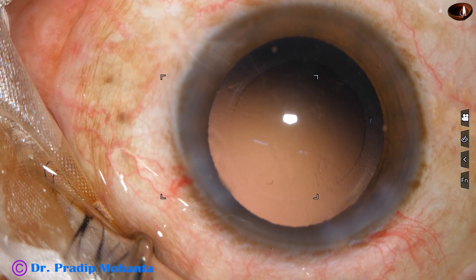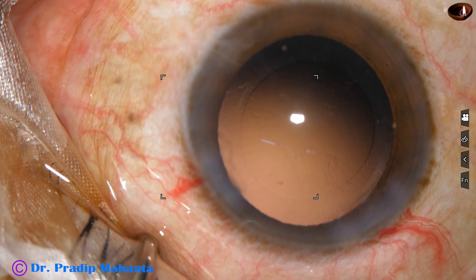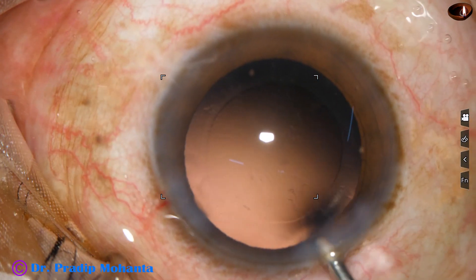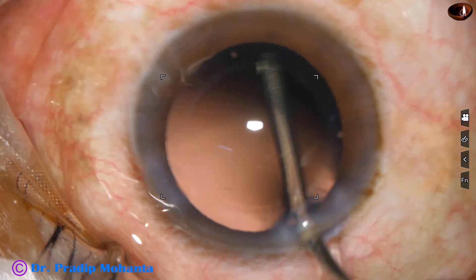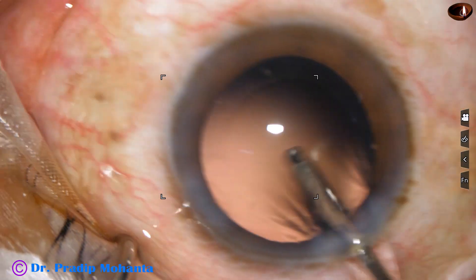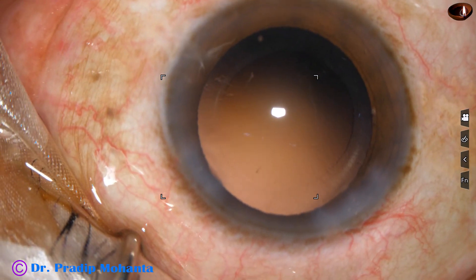Now we can see the rhexis. The rhexis is almost a circle — almost a femtosecond laser circle. And if we train our hands, we can do this in most of the cases. Now this is hydro polish — polishing of the posterior capsule just by the irrigating probe.